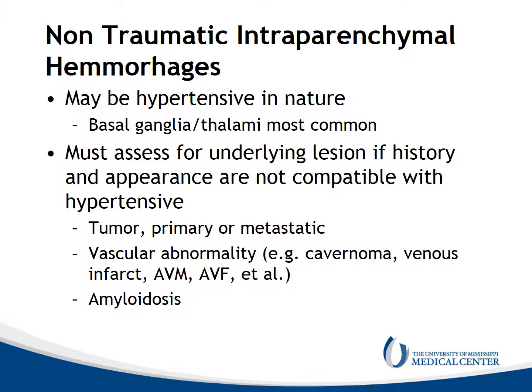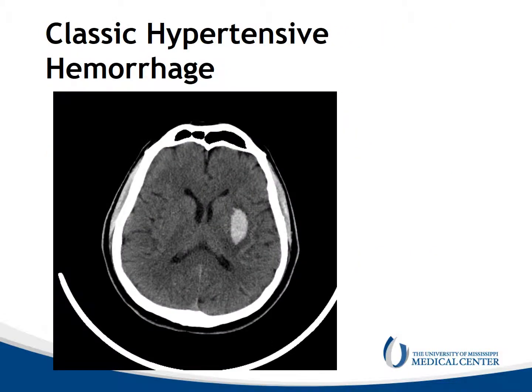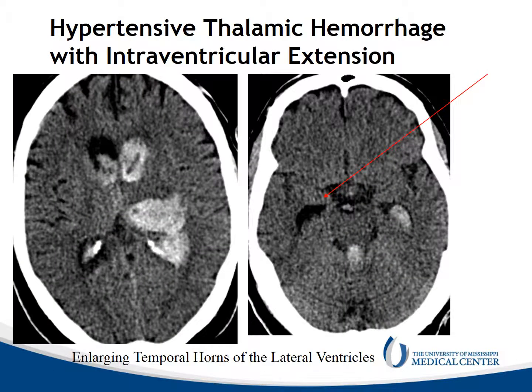Non-traumatic intraparenchymal hemorrhages also occur. These may be hypertensive in nature; the basal ganglia and thalami are most commonly involved. One must assess for underlying lesions if the appearance is not characteristic of a hypertensive type hemorrhage — in that case you'd be looking for tumors, vascular abnormalities, or underlying diseases like amyloidosis. An MRI or CTA would likely be used. This is a classic hypertensive hemorrhage located in the left basal ganglia with surrounding edema. Here's another hypertensive type hemorrhage in the thalamus with intraventricular extension, and we can see the temporal horns are enlarging, reflecting developing ventriculomegaly and hydrocephalus.